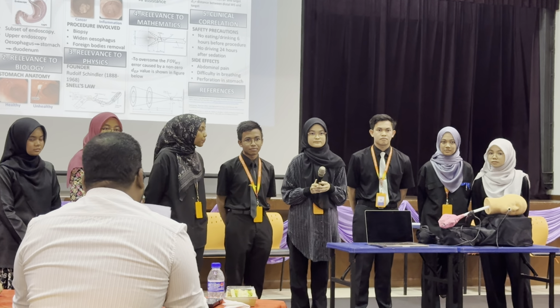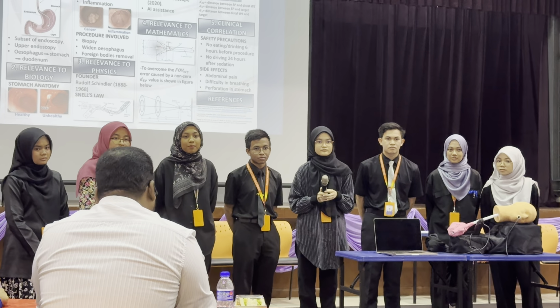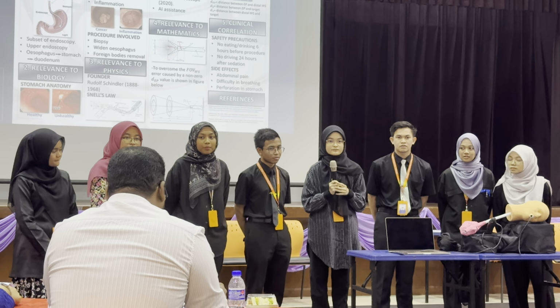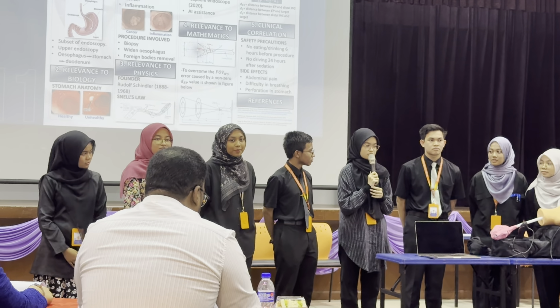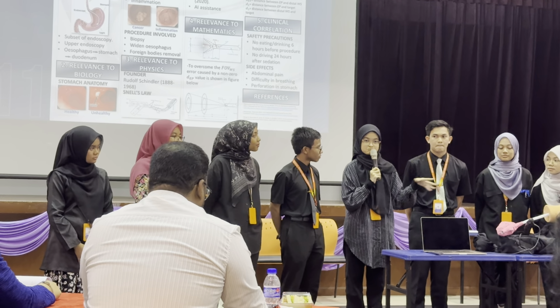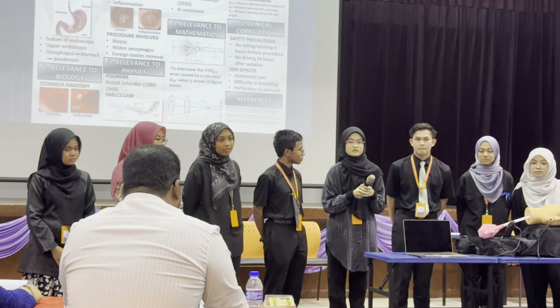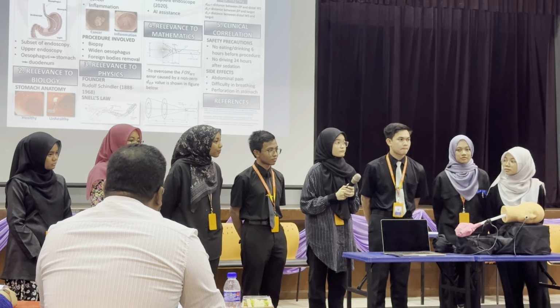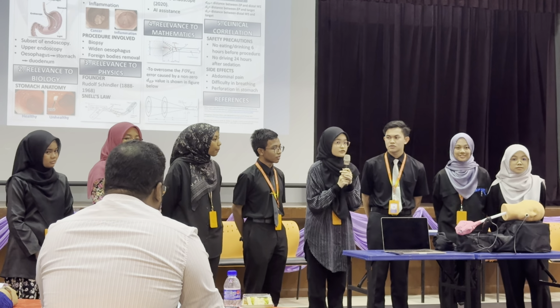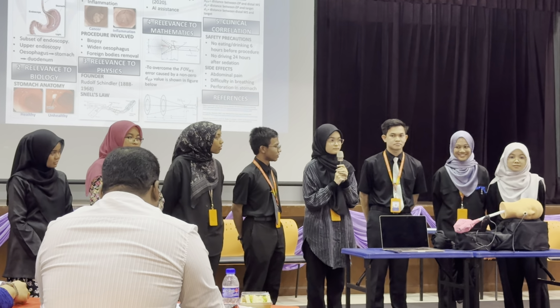And endoscopy covers everything, right? What are the things endoscopy can view? Endoscopy is the general term. We can view the lungs, the intestine, the whole GI tract. Yes.